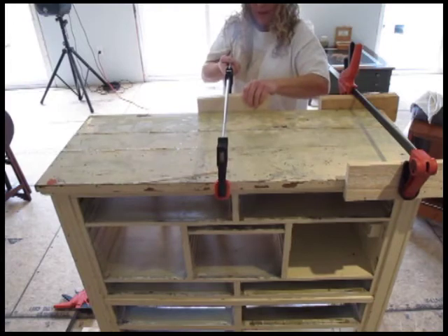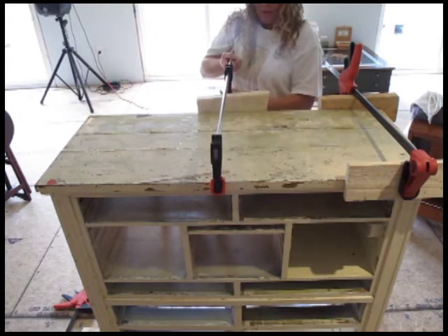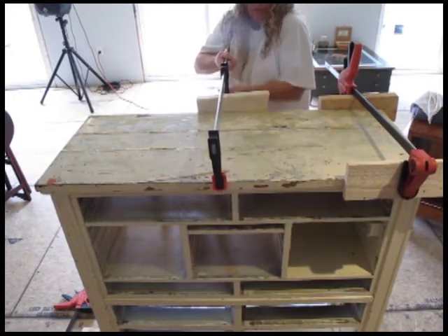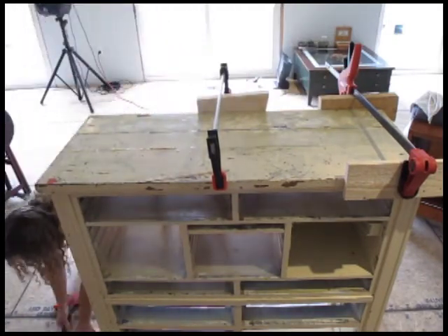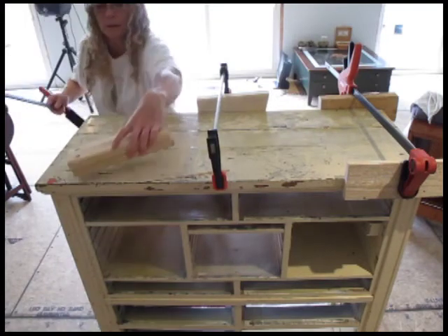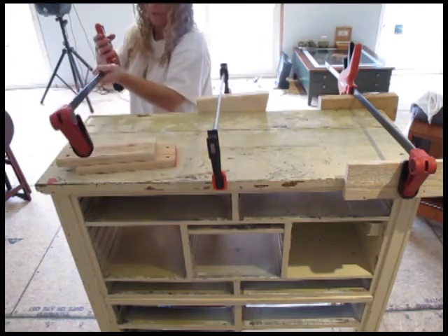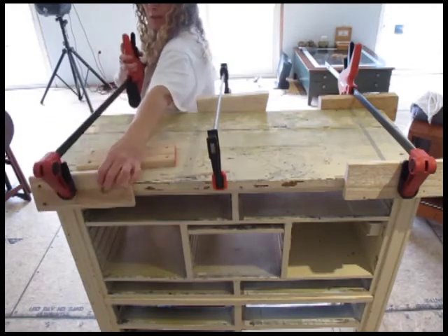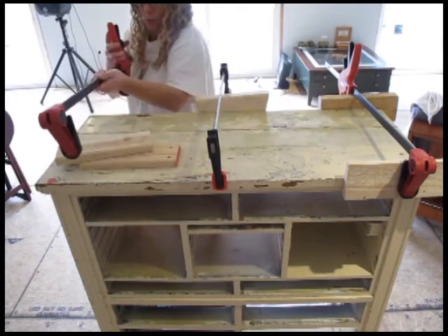Okay, so there's that one, there's that one. I'm going to hold this like that, and I'm going to screw this thing. And I'm not going to use a block over there because I can't figure out how. And then this one is going to be like the first one. So it's going to go, hold it by the handle first. Get this thing as close as you can to where you need it first. Okay, so I need it way up here.